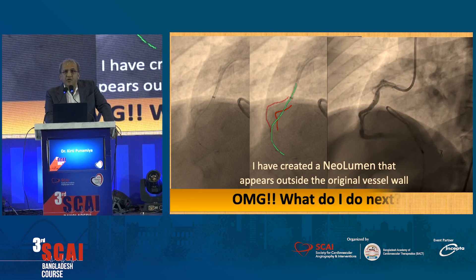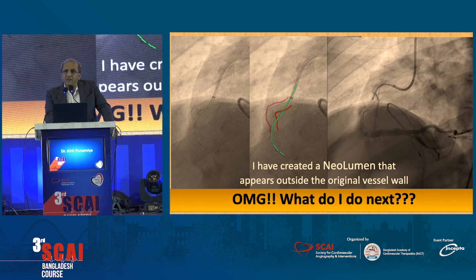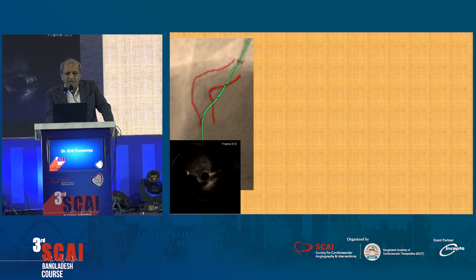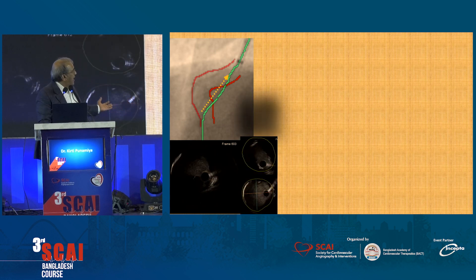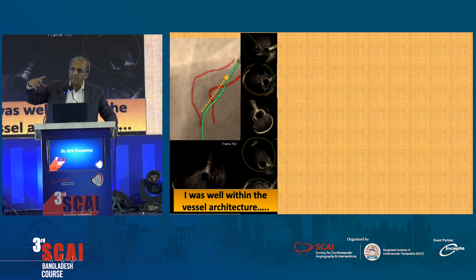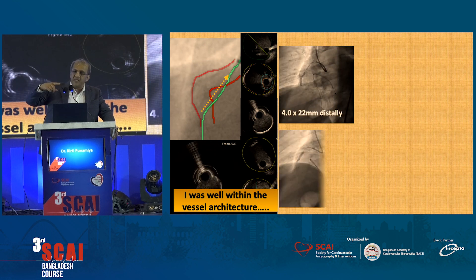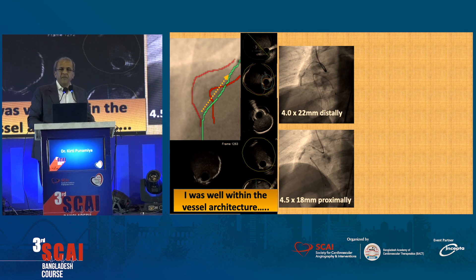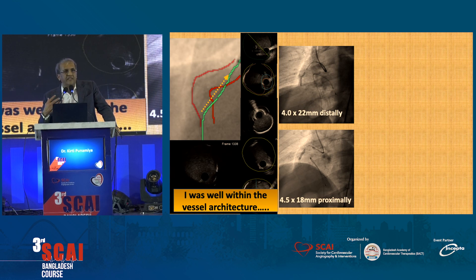We got the opportunity to study these neolumens, and we've now studied around six or seven of them with intravascular imaging. What we found is that when we do an IVUS, you can see the EEL surrounding everything — everything that happens is happening within the EEL or the media. At every image, the yellow circle is the media, and you can see that the figure-of-eight happens within the yellow circle.